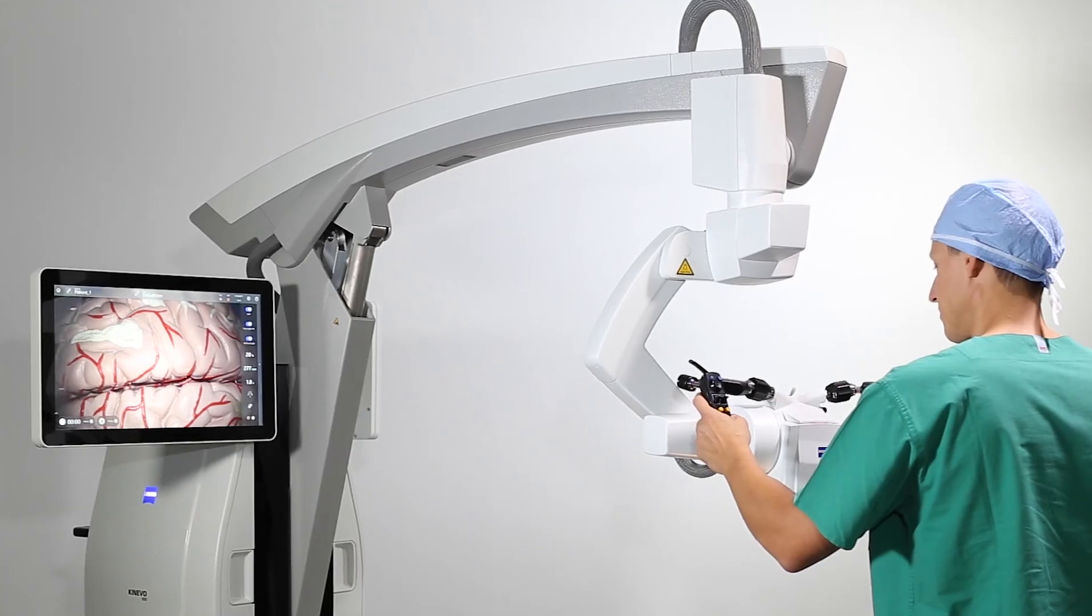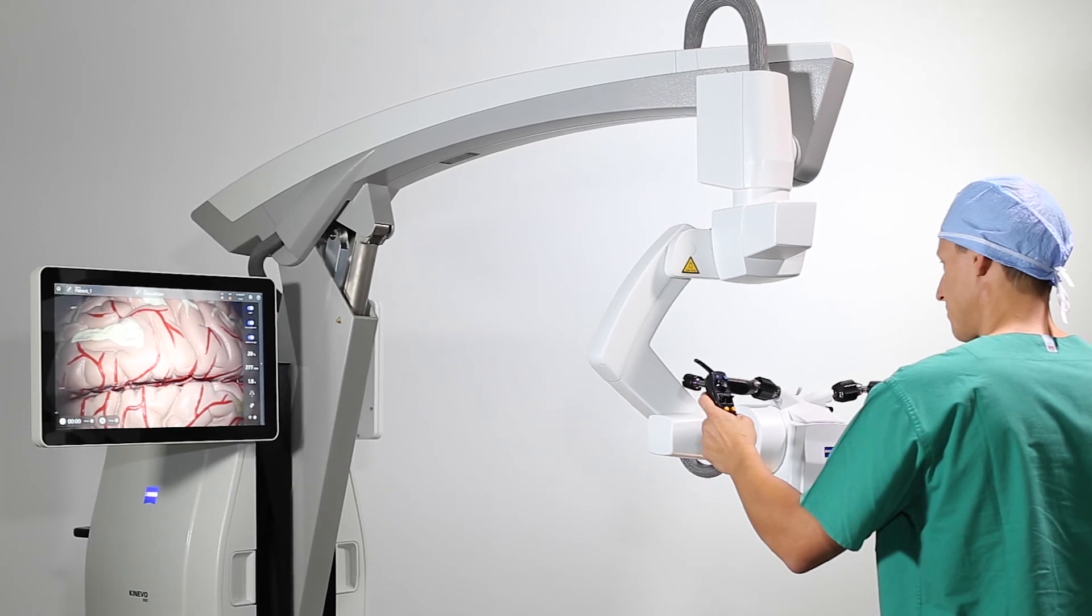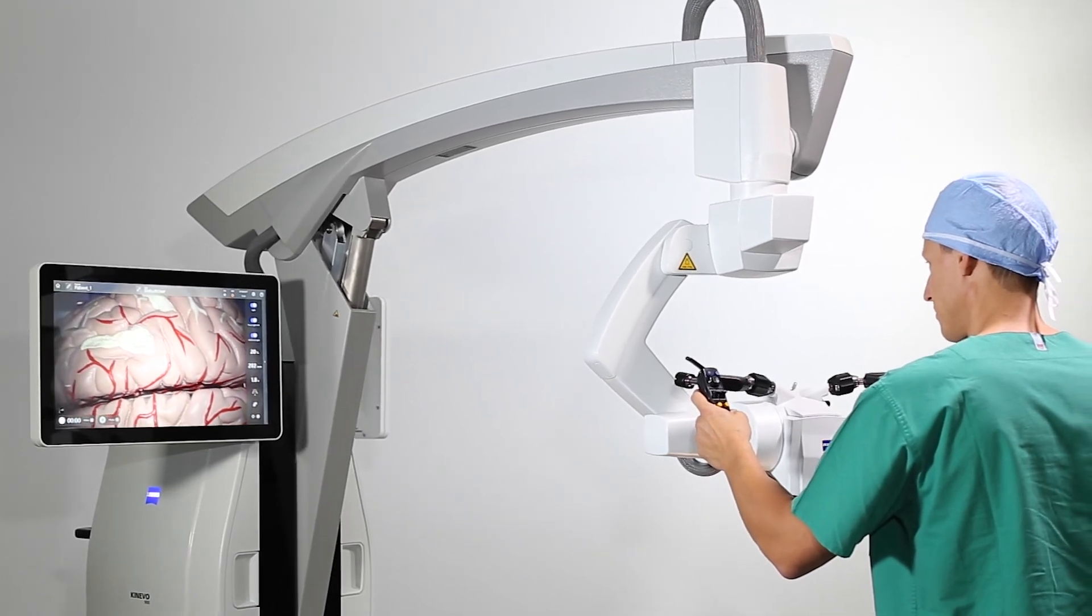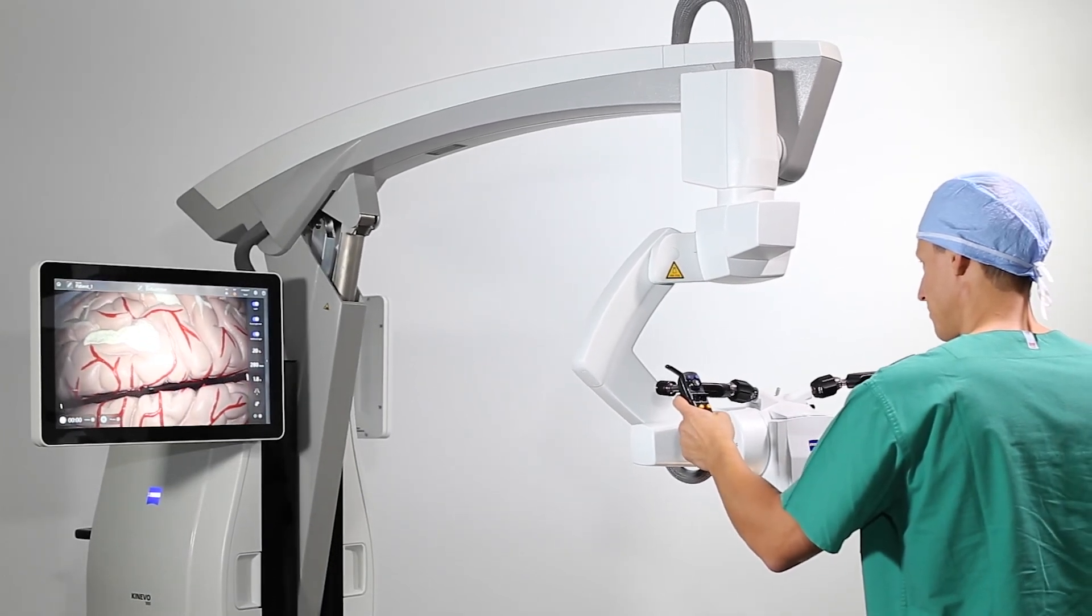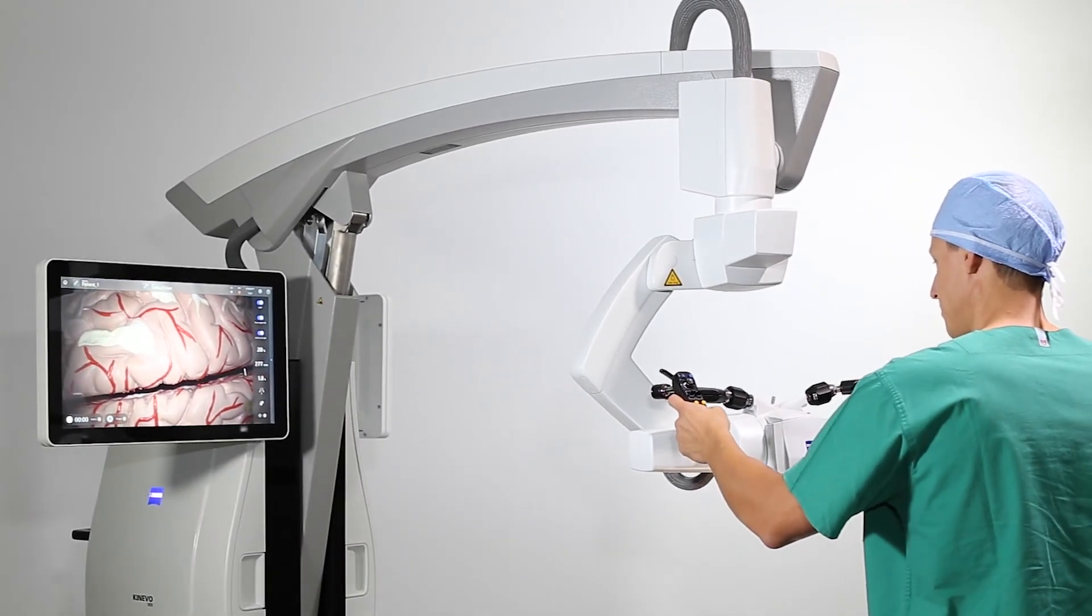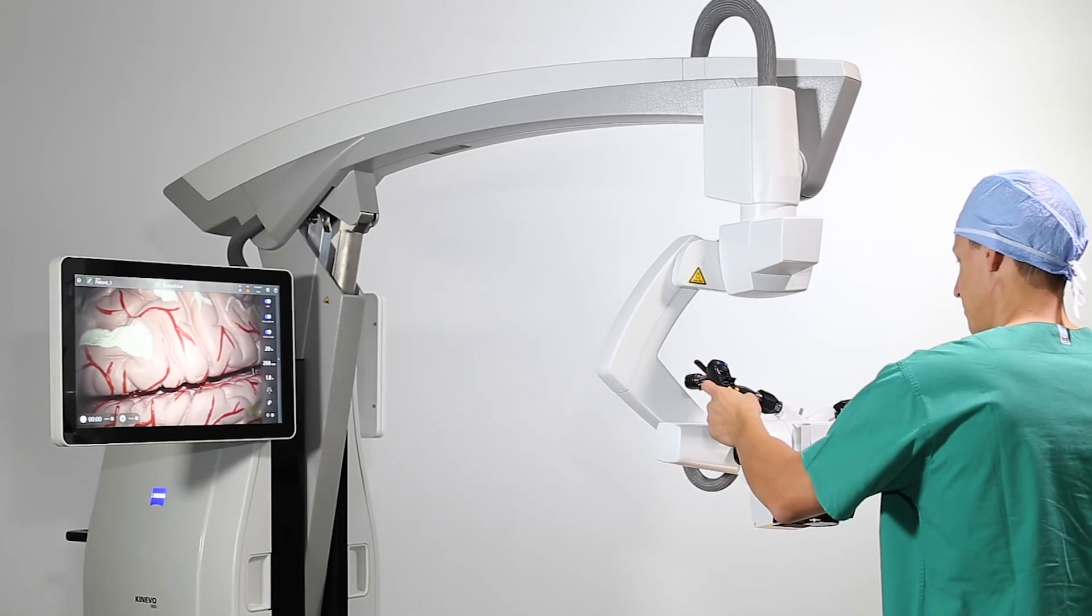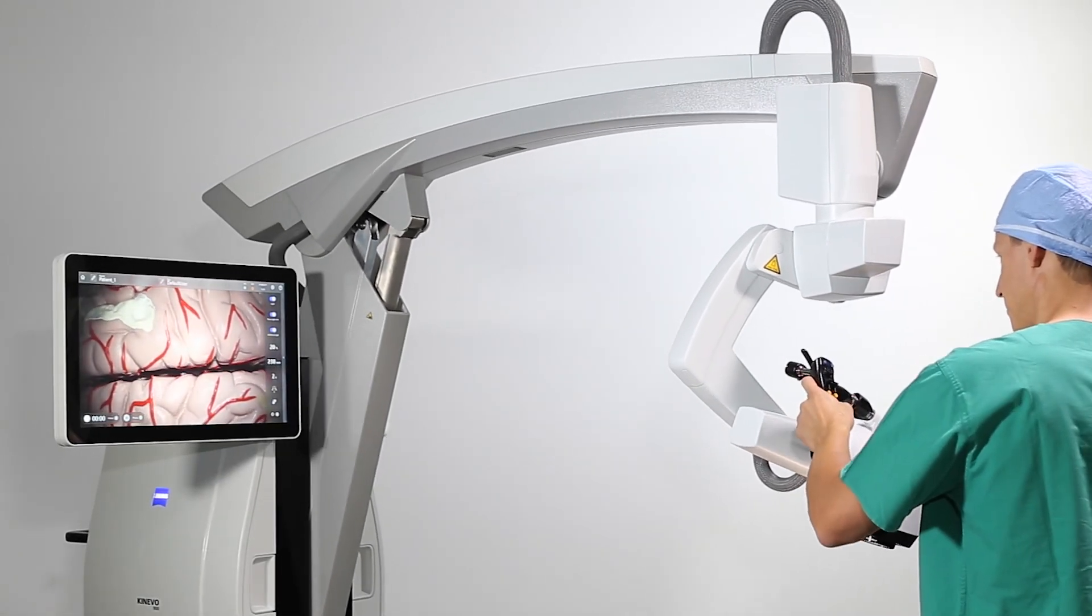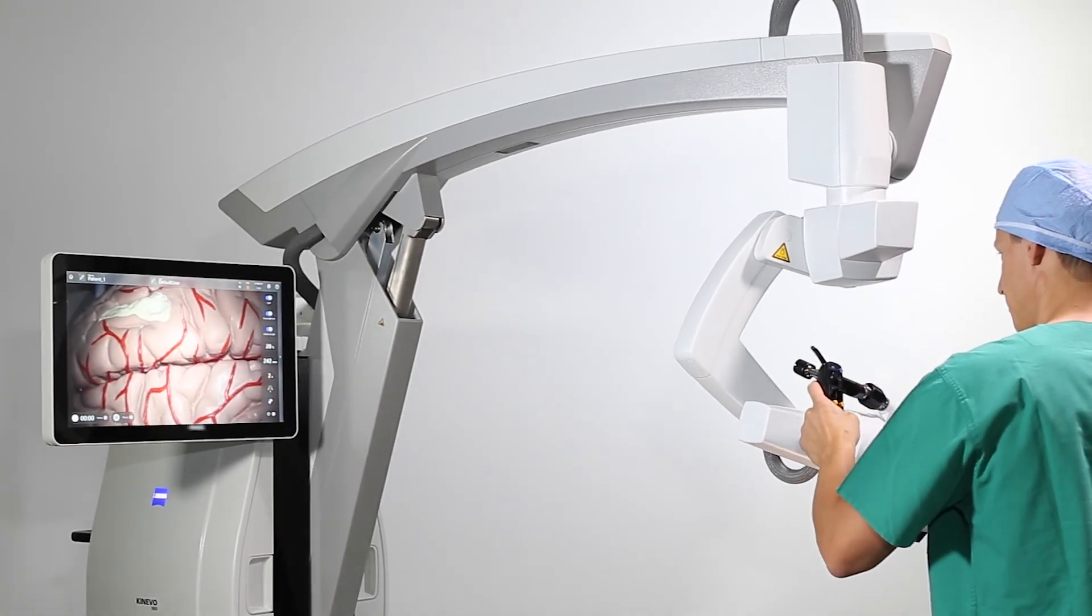With a push of a button, Zeiss Kinevo 900 can pivot around the focus point and enable you to change the angle of observation without losing its anatomical focus.